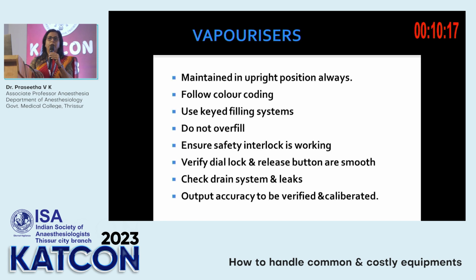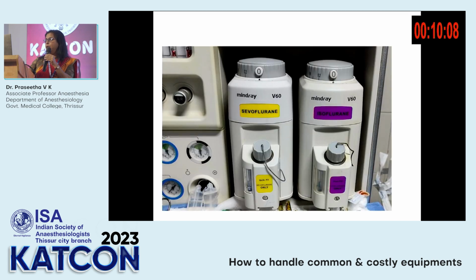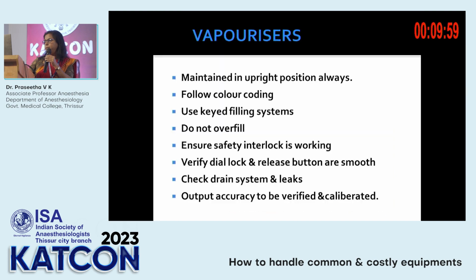And always follow the color coding when you are using vaporizers, and use filling systems which are dedicated for each agent. Do not overfill. You have a viewer port in your vaporizers where there is a maximum level indicator. You do not fill beyond that point.